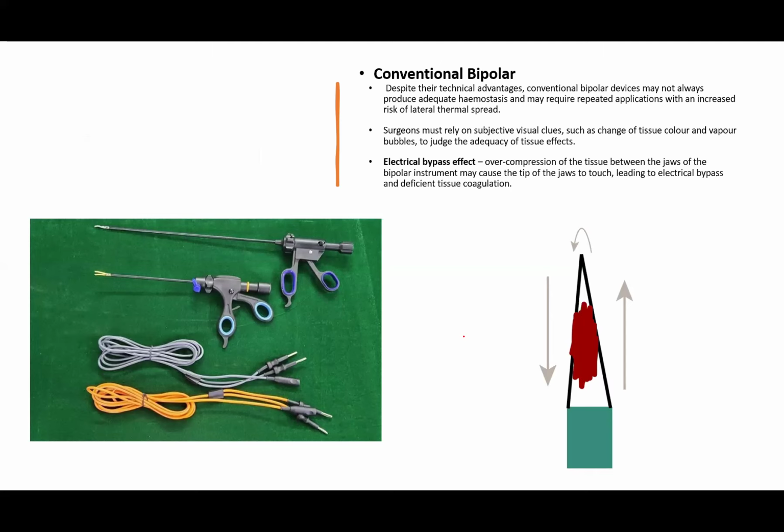Now, let's see one important electrical bypass effect of a bipolar instrument, the conventional bipolar.